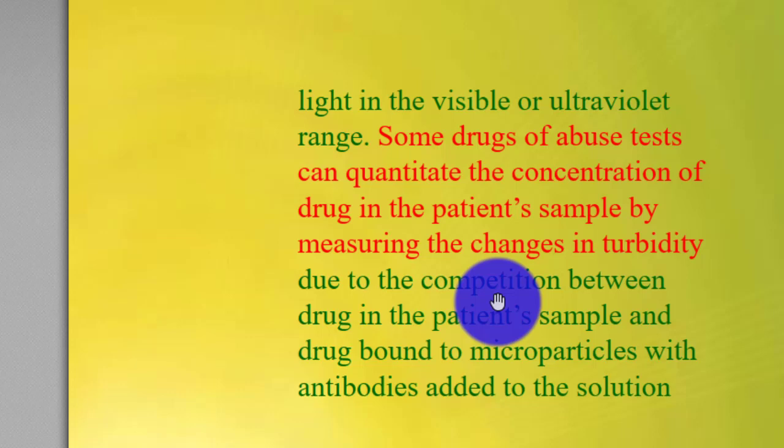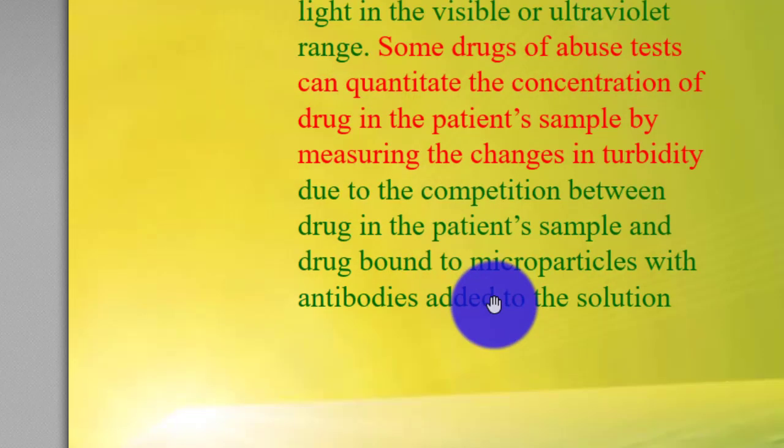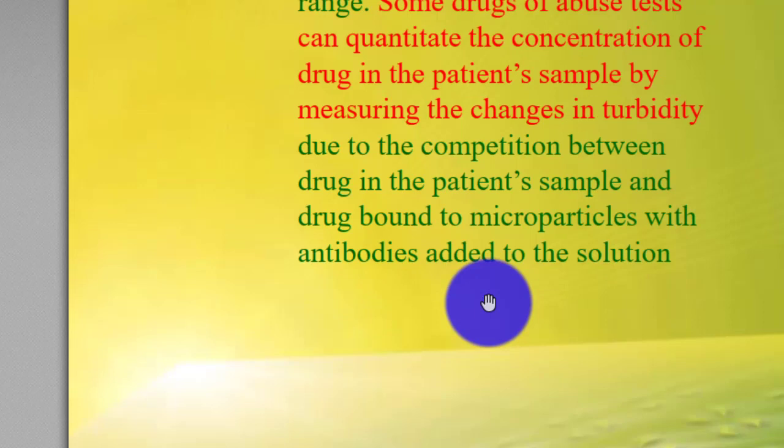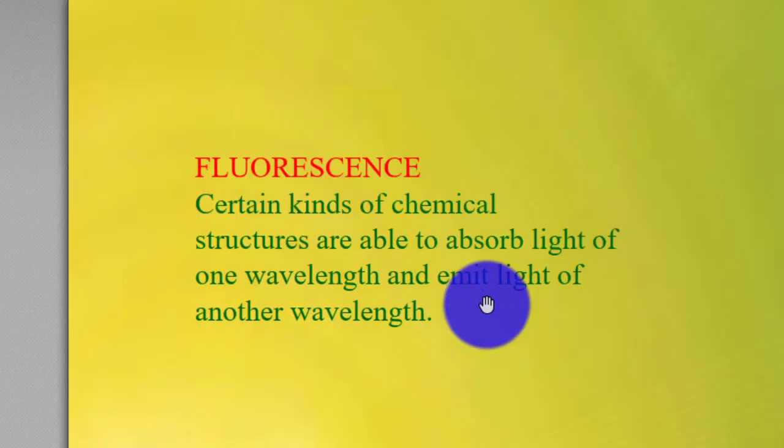Some drugs of abuse tests can quantitate the concentration of drug in the patient sample by measuring the change in turbidity due to the competition between drug in the patient sample and drug bound to microparticles with antibody added to the solution. Fluorescence.